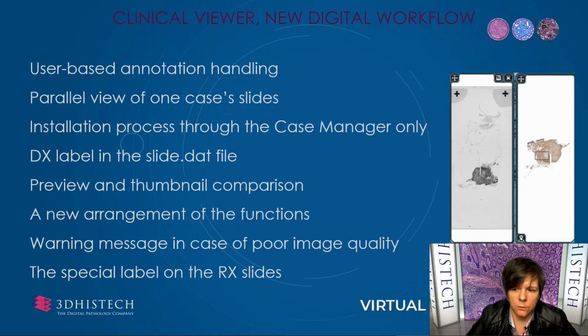The clinical viewer can open different slides, DX and RX as well. But in the case of a slide produced by an RX scanner or research scanner software, a label will appear on the digital slide. Furthermore, poor image quality of the slide will also show a warning message to the user.